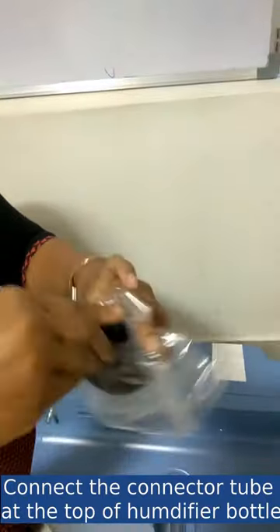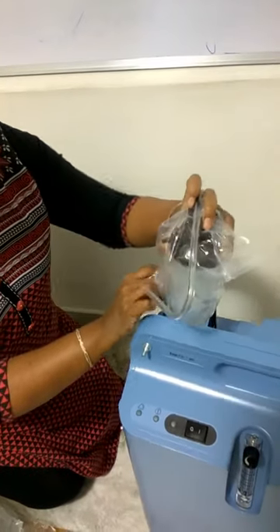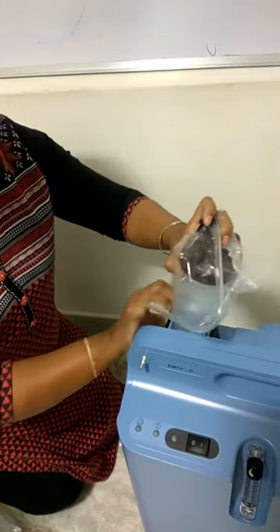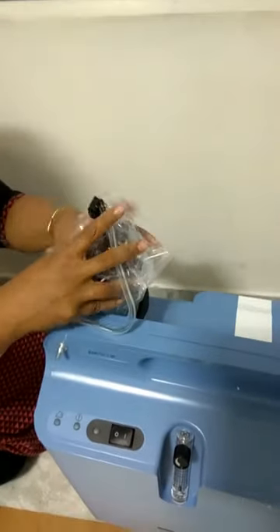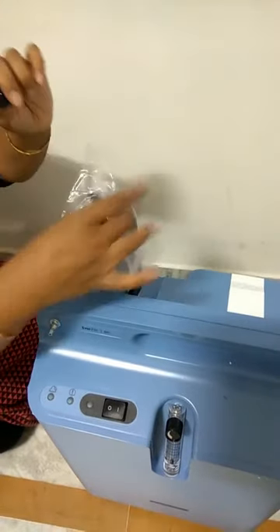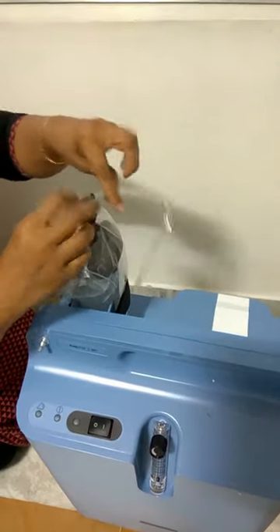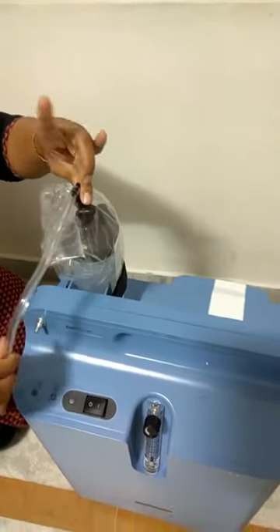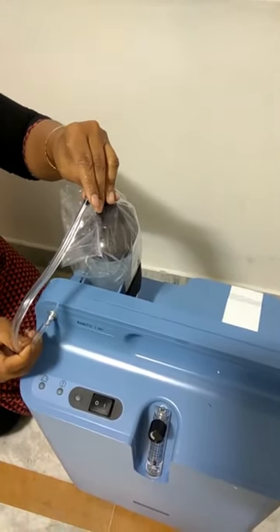You have to connect this with the humidifier bottle like this. You have to turn on the screw and then fix this over here. Put the minimum level of water, or optimum level. I am not opening this because this is a new product. Just fix this with the black screw, and then attach the other end here.